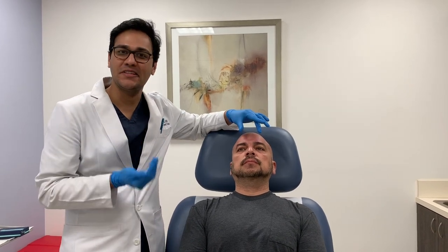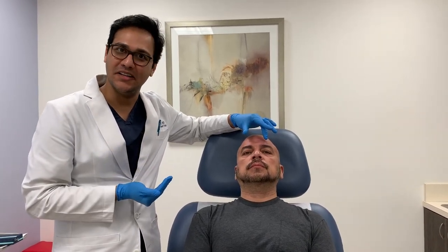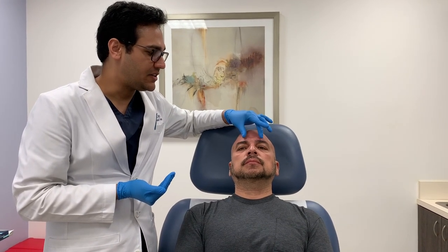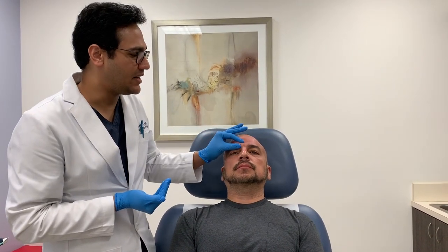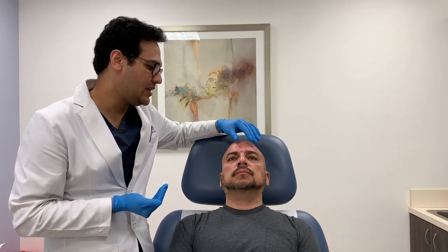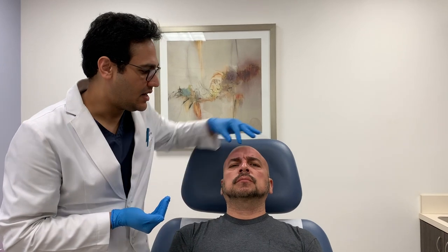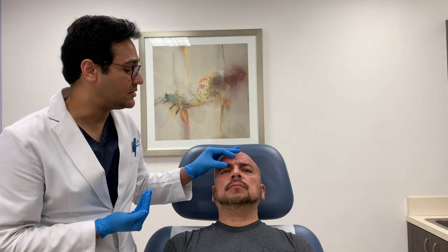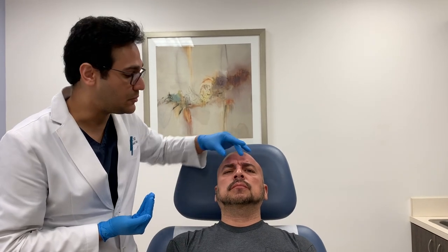This patient has graciously volunteered and given us permission for this video. He's going to frown here so you can see his two corrugator muscles, which are responsible for the frown lines. You can see he's a guy with pretty big corrugator muscles, and these are going to respond nicely to Dysport.